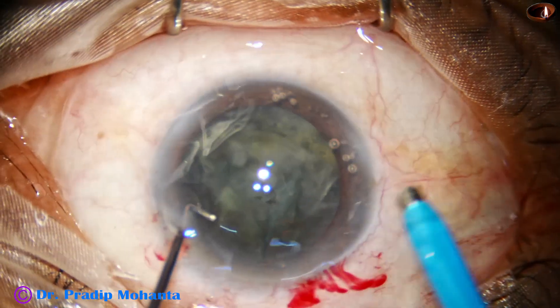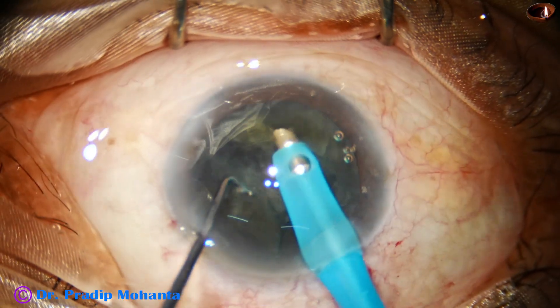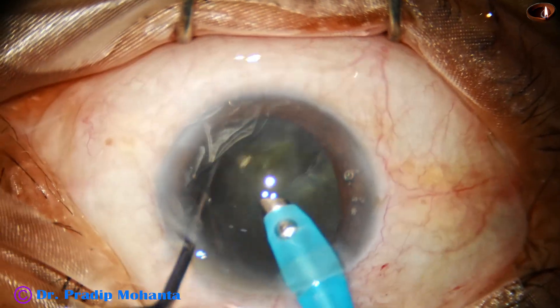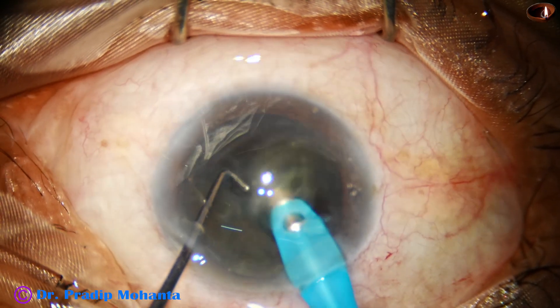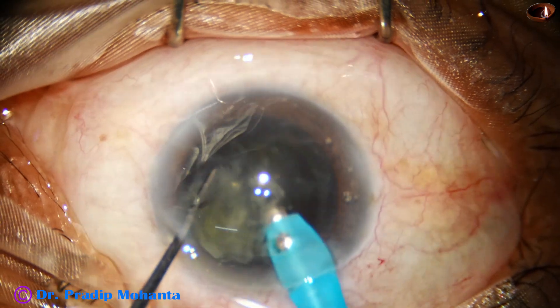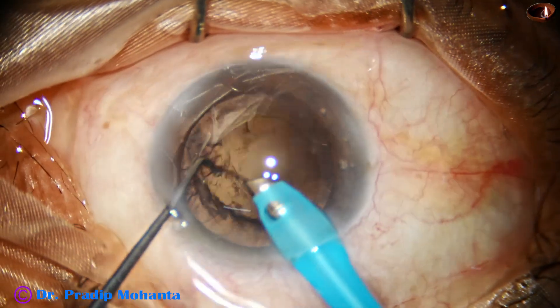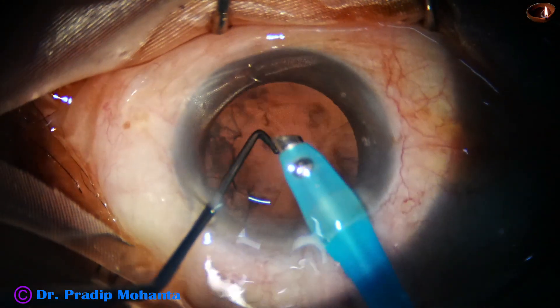Now the phaco needle goes in. Some superficial cortical lens matter is removed and the free nuclear fragments are picked up and emulsified. Ultrasonic energy used is 60 percent. Vacuum is 490 millimeters of mercury and flow rate is 48 ml per minute.